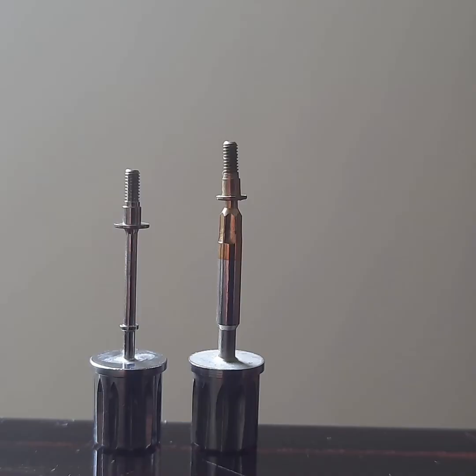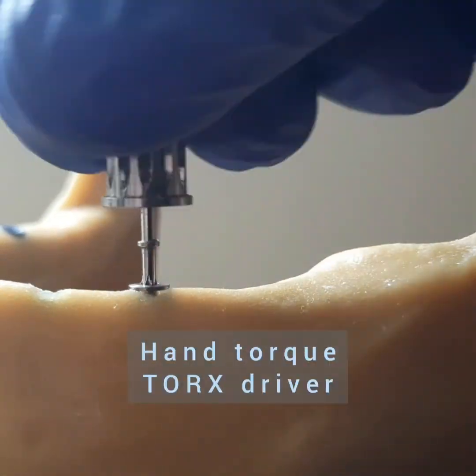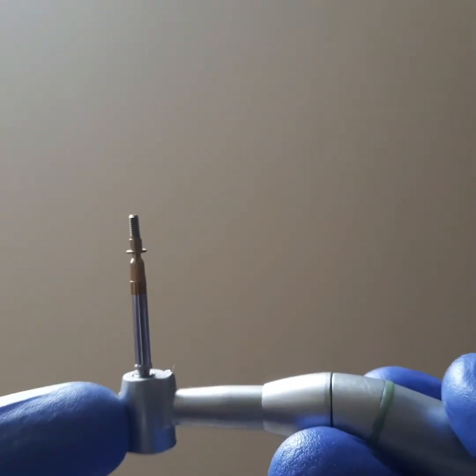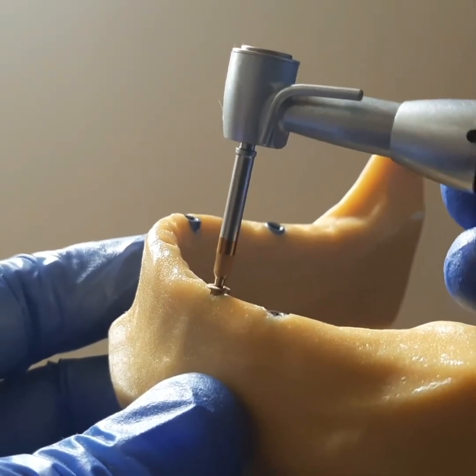The cover screw can be delivered with a variety of tools — with the hand driver or torques as conventionally done, or even with the physio dispenser using the implant carrier to deliver the cover screw to the site.